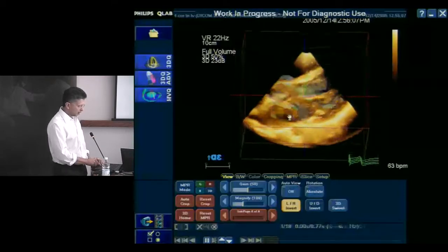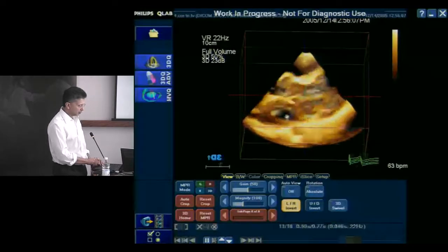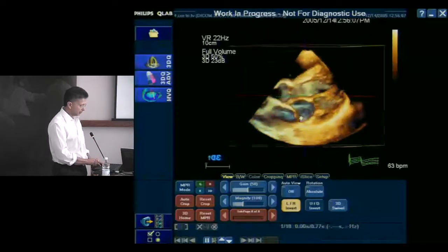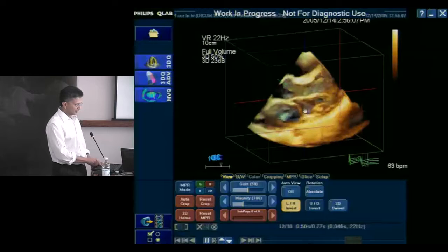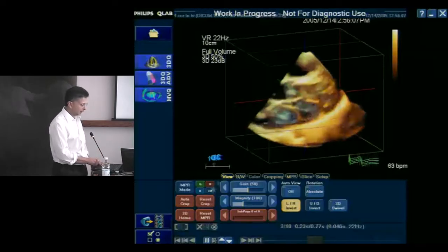And those are the, watch when they come into view right there. You see, those are two left pulmonary veins coming into the cor, into the upstream part of the chamber. And then over here, you're going to see another hole there, and that's the origin of the left atrial appendage. On that, you have to believe me.